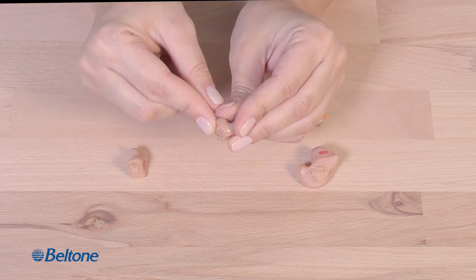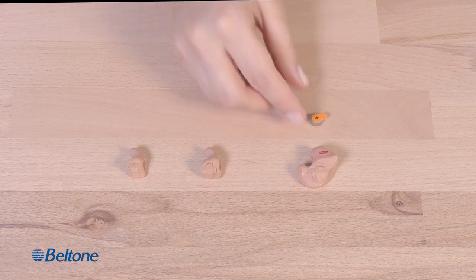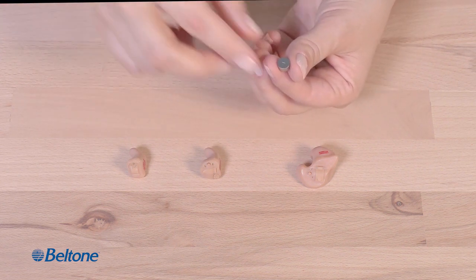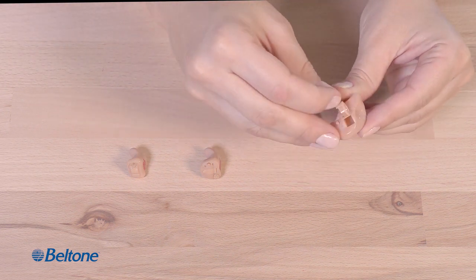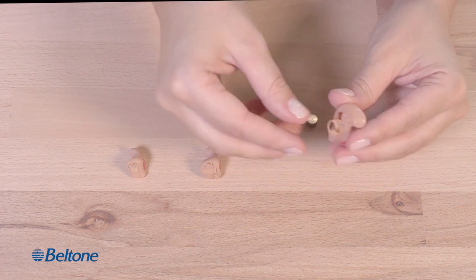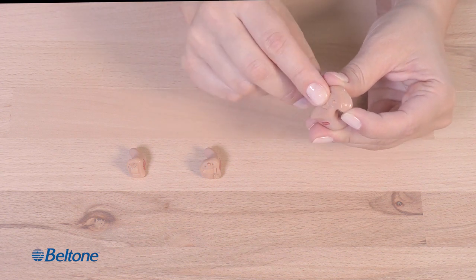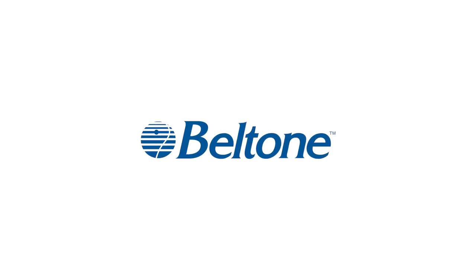They set the hearing aid back on the work surface. They pick up hearing aid ITC and pop open the battery compartment. They insert battery 13 into the open compartment tray and then slide it closed. They set the hearing aid back on the work surface. Copyright 2021 G and Hearing Care.